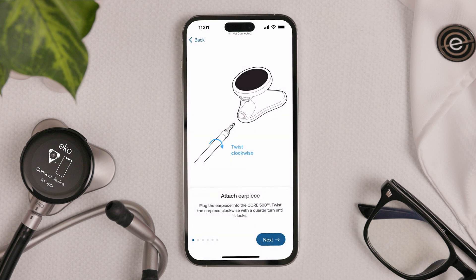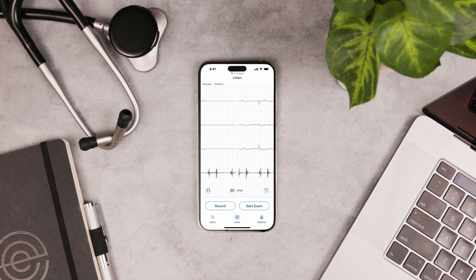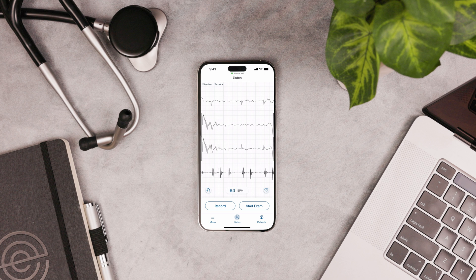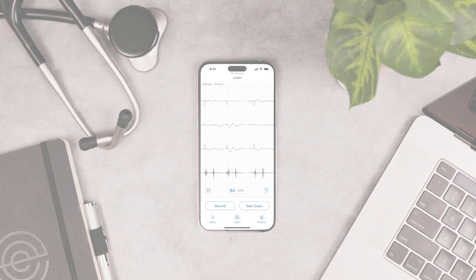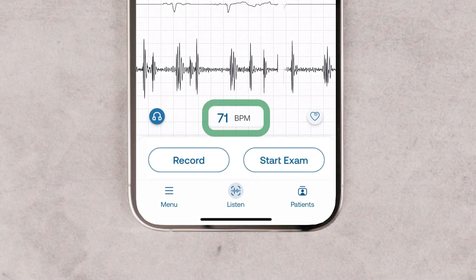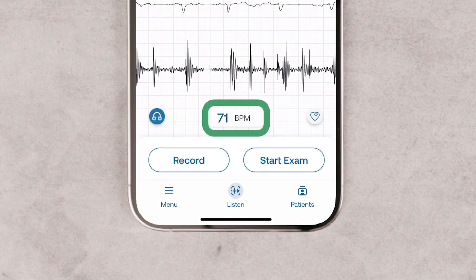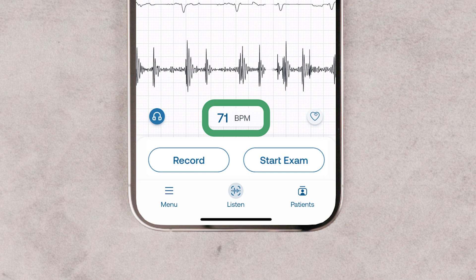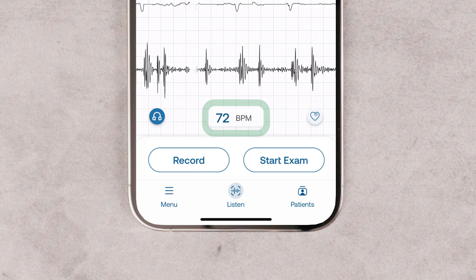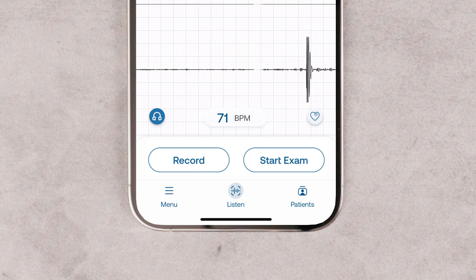Now let's take a tour of the Echo app. On the Listen screen, you can start listening to body sounds right after you open the app. This also lets you instantly visualize PCG and ECG. At the bottom of the screen is the heart rate in beats per minute. If the rate can't be detected, two dashes appear instead.